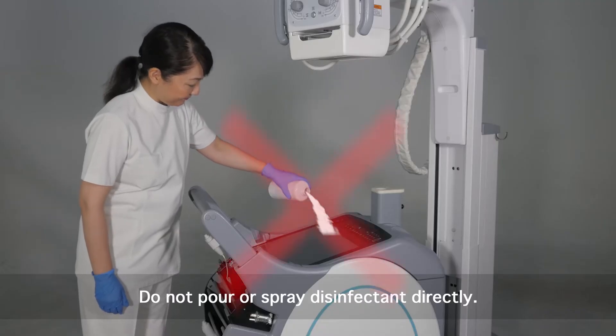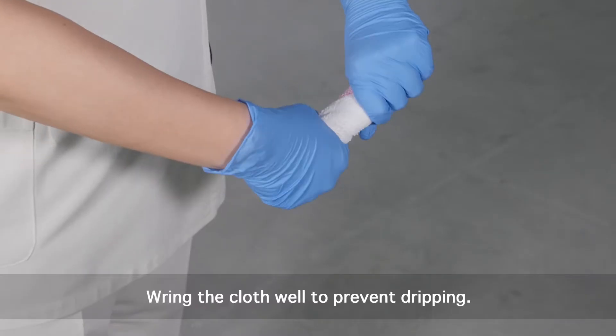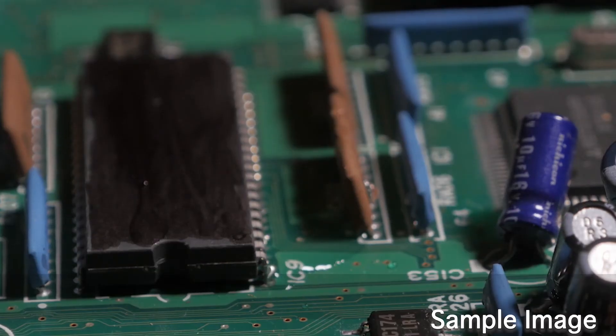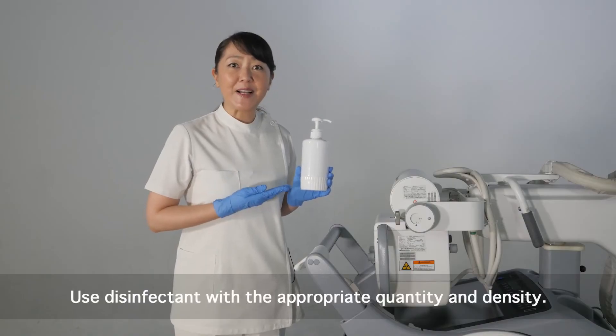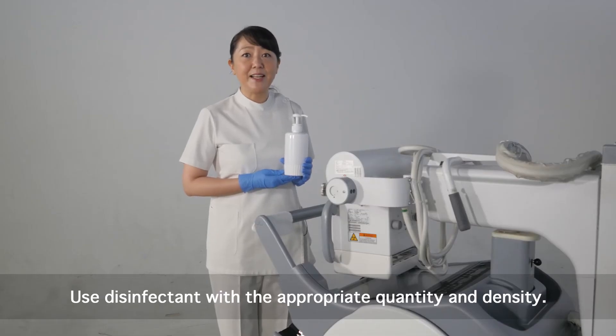Do not pour or spray disinfectant onto the equipment directly. After soaking the disinfectant in the cloth, wring it out well. Liquid may get inside the electronic parts, which may lead to failure or malfunction. Please use the disinfectant with the appropriate quantity and density. Excessive disinfection may lead to discoloring and cracking on the system surface and deterioration of rubber and plastic.